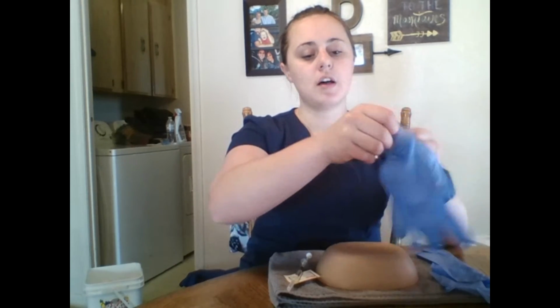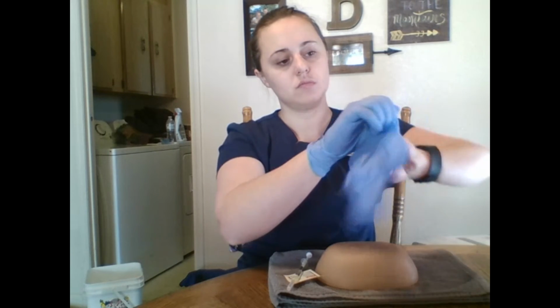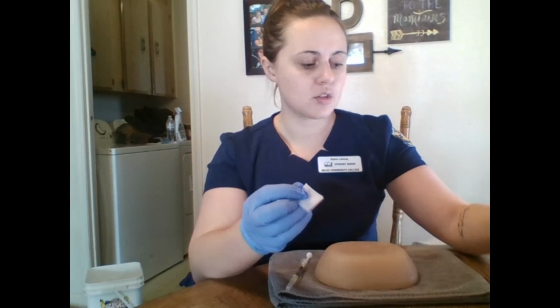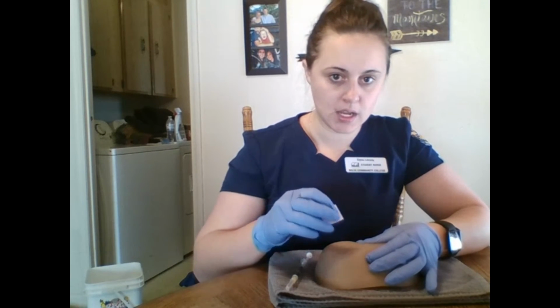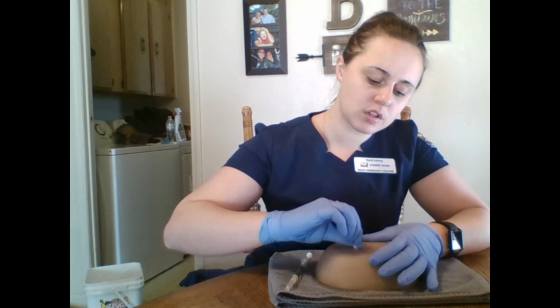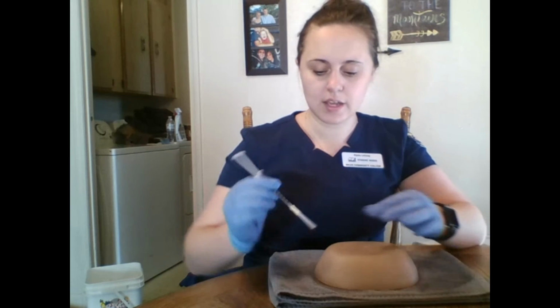I'd wash my hands, and I'd put on some gloves. And we'll take the alcohol swab. And again, I'd pick a spot 2 inches from his belly button, and I'd want to pinch it with my non-dominant hand. And so I would take my alcohol swab and go in a circular motion, starting from the inside and going out. And I'd let that dry.